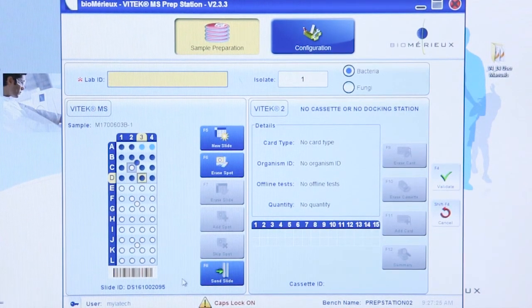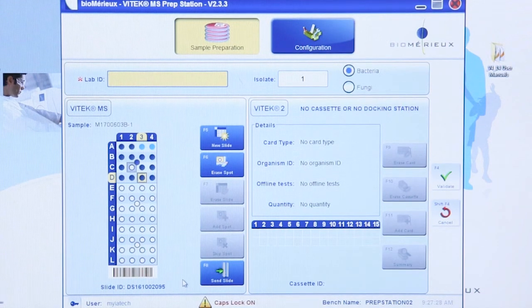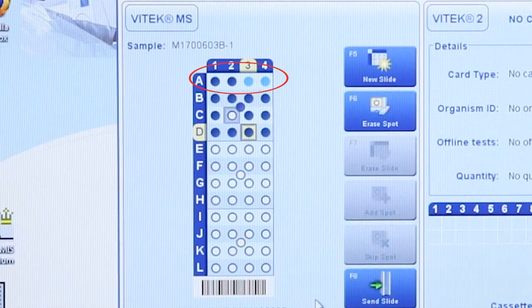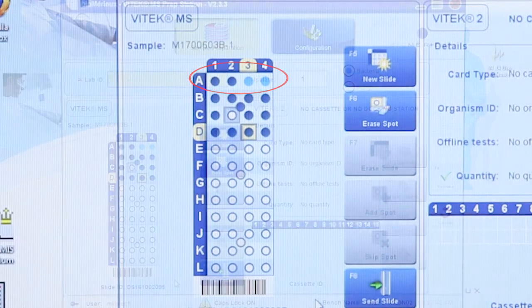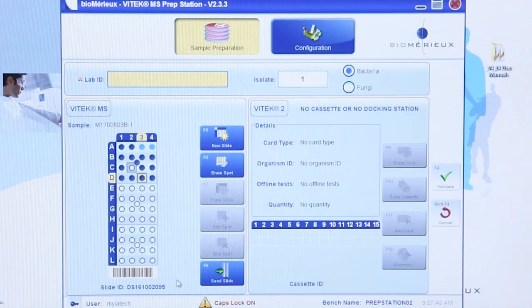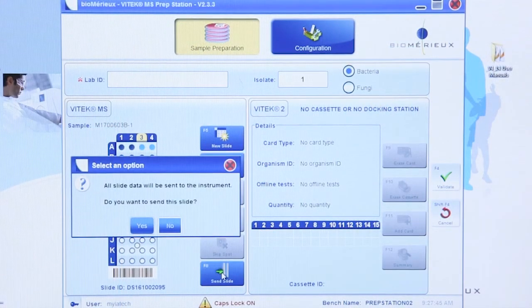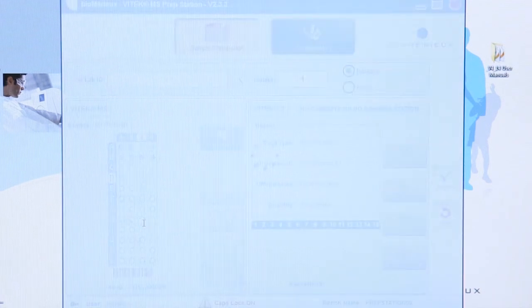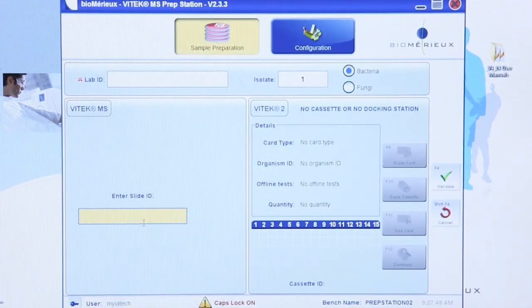In addition, verify the correct organism type was selected — either bacteria or fungi — by noting the color of the spot. Information is sent to the Vitec MS by clicking the Send Slide button. Once sent, the slide can be tested on the instrument.